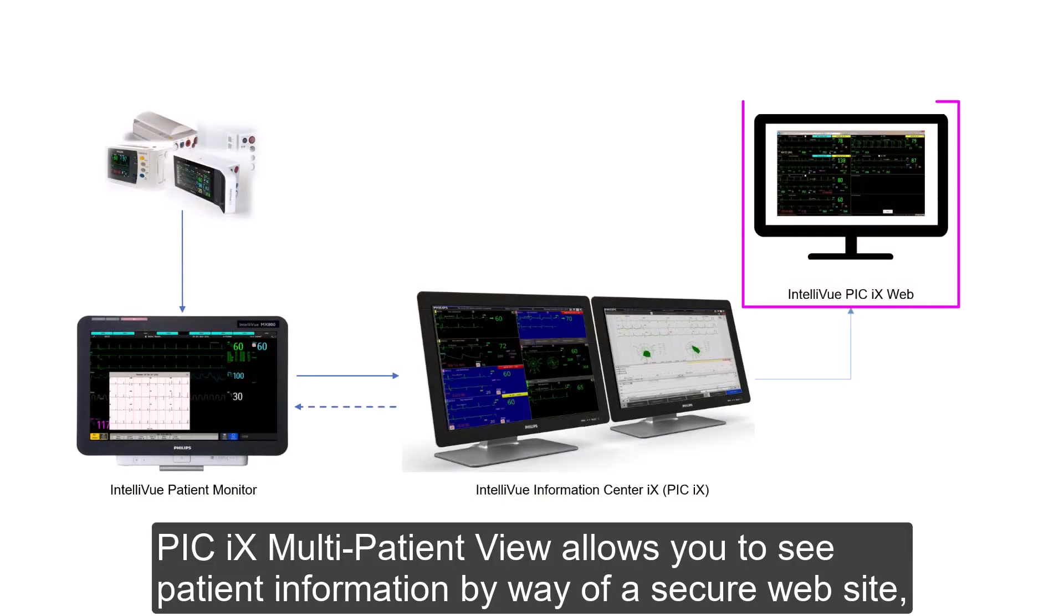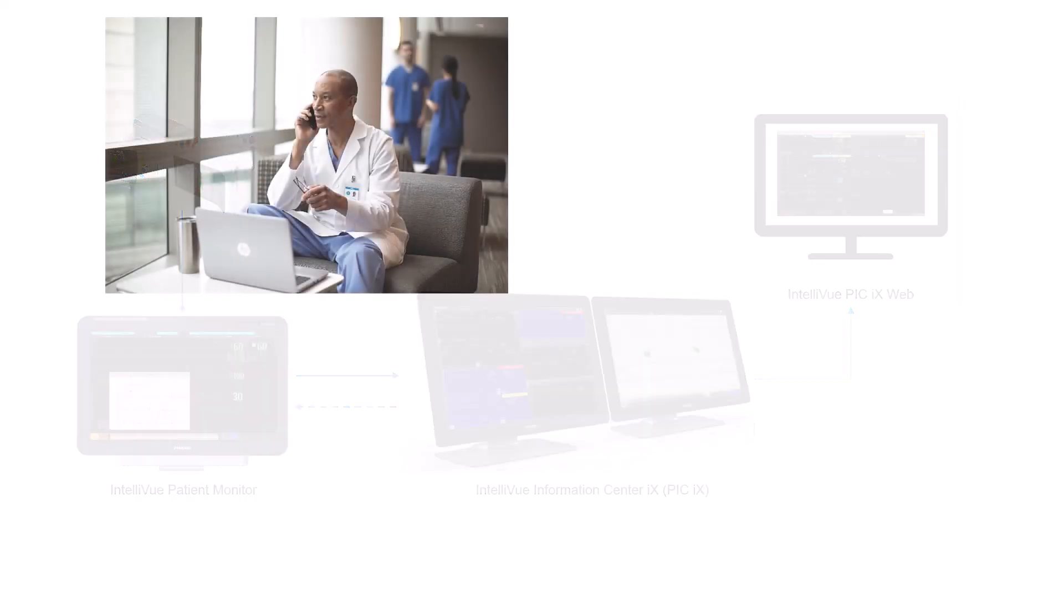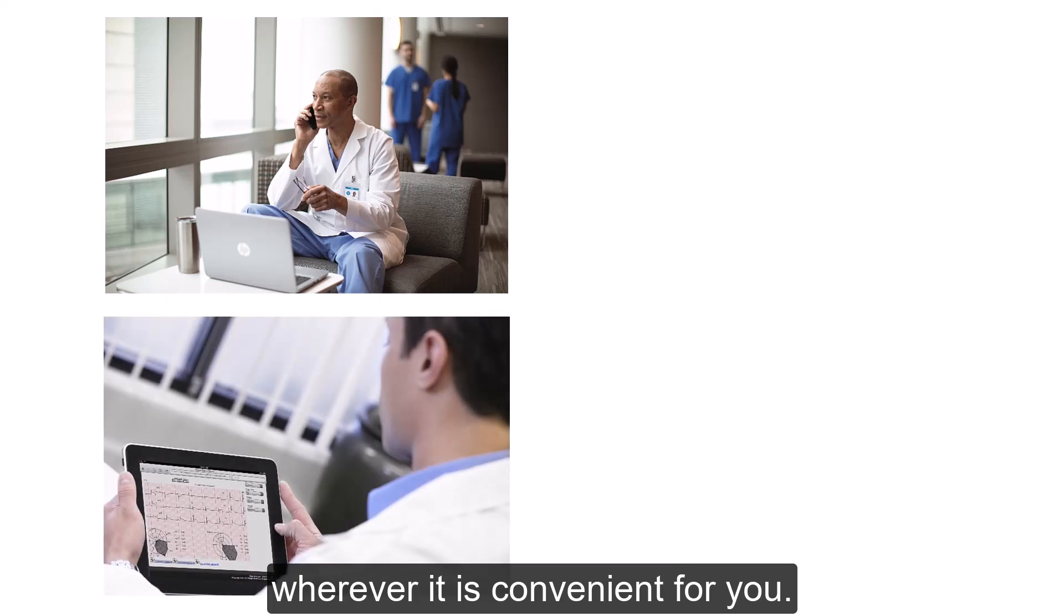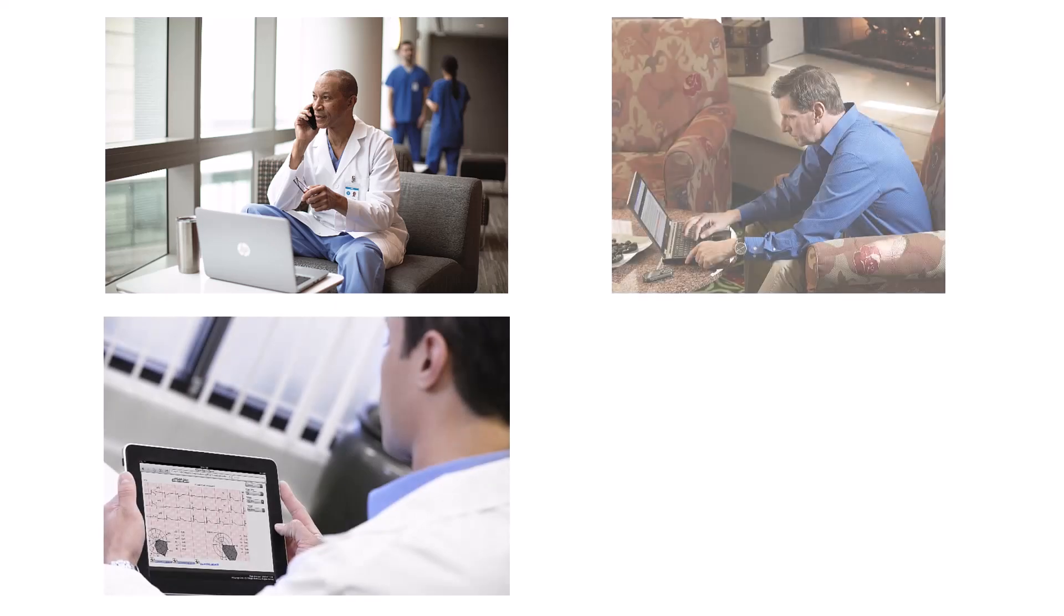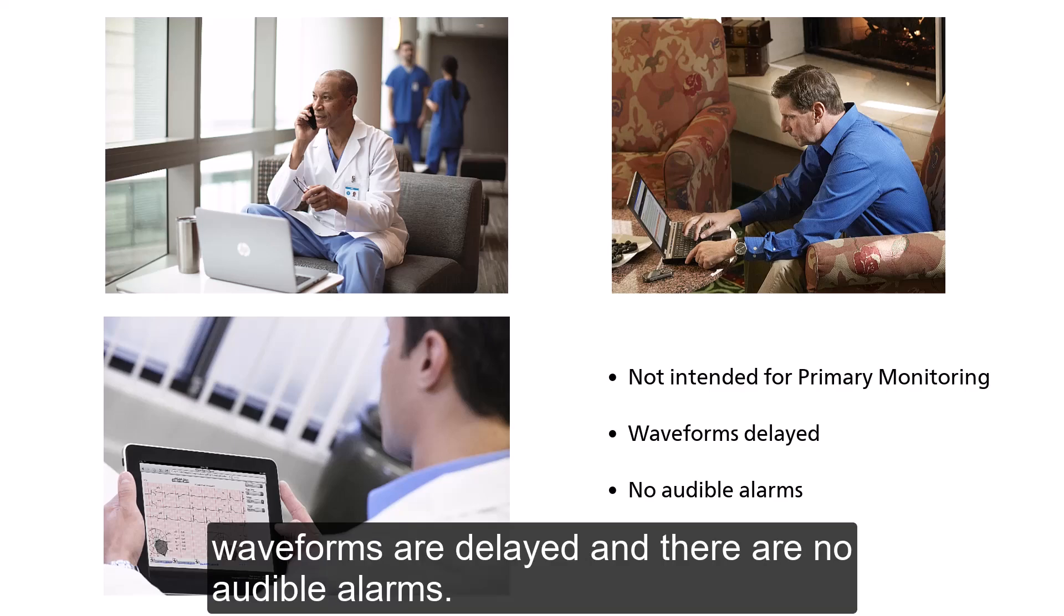PIC iX Multi Patient View allows you to see patient information by way of a secure website, wherever it is convenient for you. Please note that this application is not intended for primary monitoring, as the displayed waveforms are delayed and there are no audible alarms.